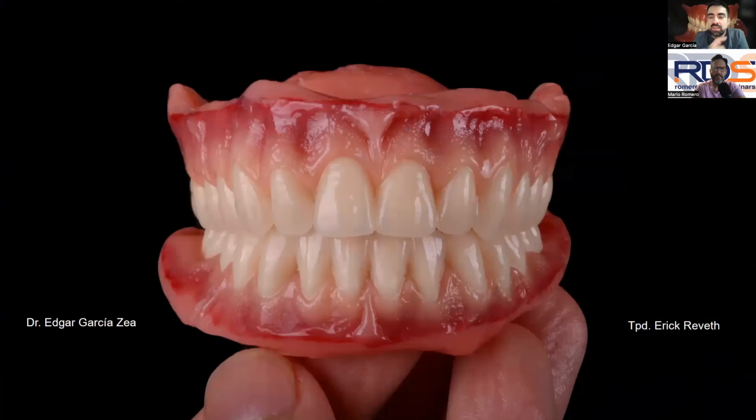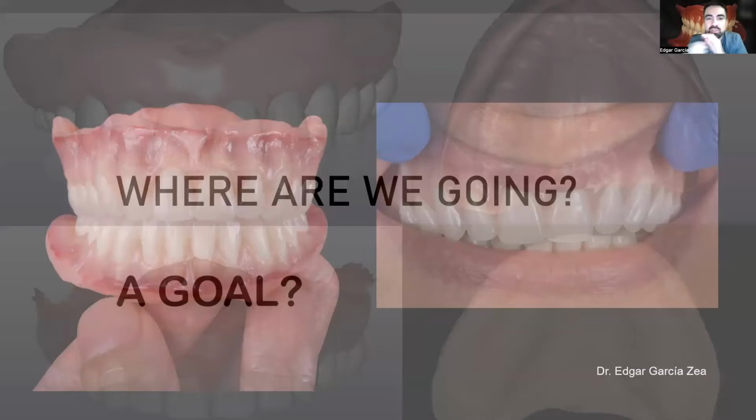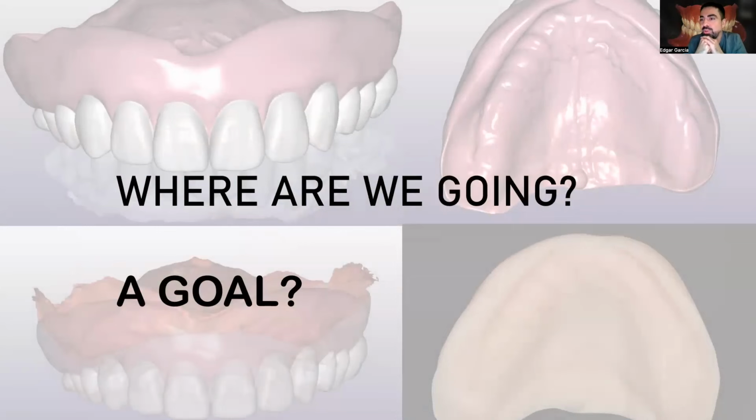Many people think that the most important thing in dentures is aesthetics, the characterization, not only the dentist but the labs. They want to make beautiful dentures, but this is not the important thing. This is a plus. This is not the main goal of our treatment, okay? Because none of our patients go around every day showing their beautiful gums, okay? We have to stop and think about where we're going and what our goal is, not only in life but also in dentistry.